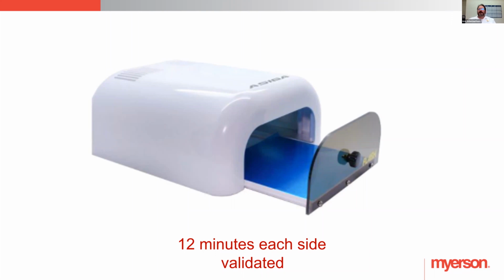I would not recommend mixing. It's interesting that I found out that when you validate a printer, at the same time you're validating that printer's curing unit, and things can really get affected comparably between that. So if you go from an Asiga printer and then cure it in a different unit, you could actually deteriorate the appliance, possibly in fit, but definitely in shade. Tooth shades can get affected by being over cured, and of course strength can be affected by being under cured. So you really try to keep things consistent and really follow that instruction.